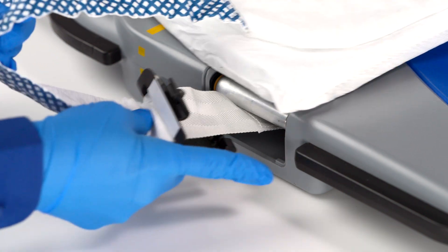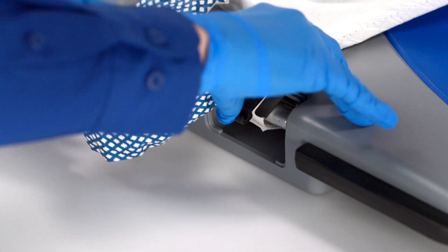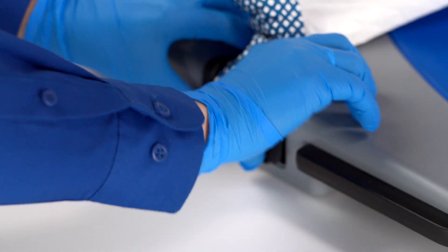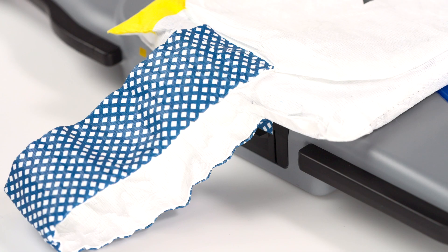To secure the band, insert the short side of the band guard into the top of the guard port. Push the long side of the band guard into the bottom of the guard port, fully snapping the band guard into the guard port. Repeat these steps on the other side.